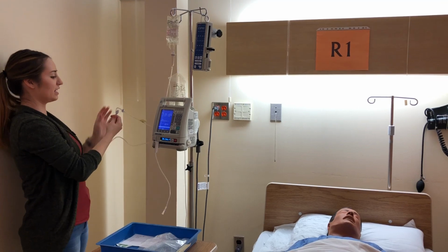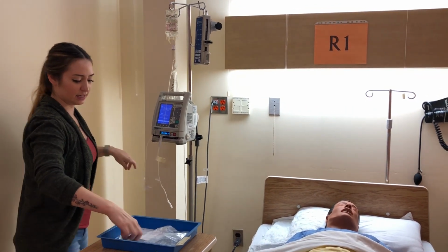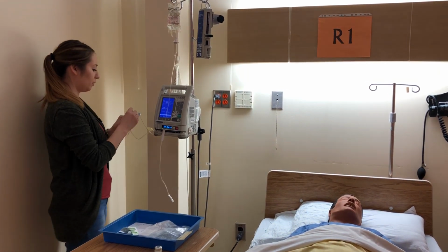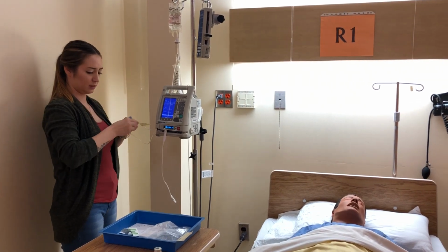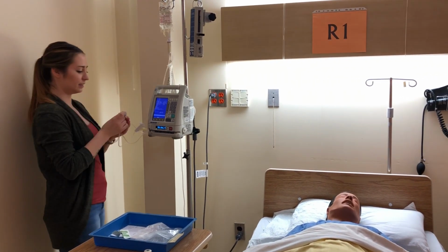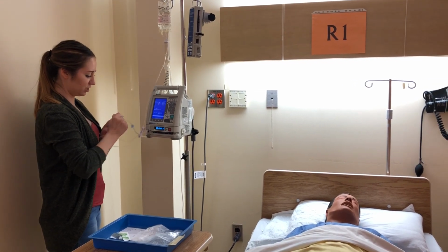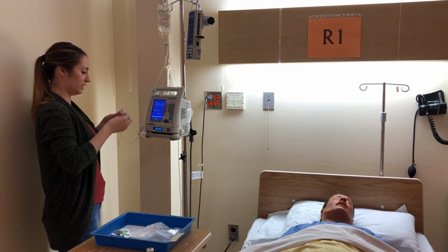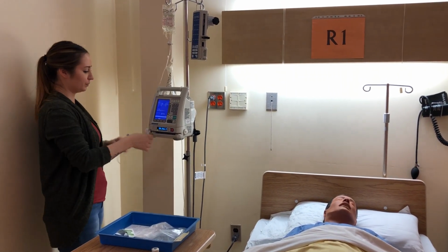I'm going to choose to attach it to the port above the Baxter pump so that the pump can regulate the medication. I'm going to swab the port for 30 seconds and let it dry for 15 seconds. I'm also going to check the compatibility. This drug is compatible with D5W, and because the doctor didn't order any D5W, we're just going to leave it. Then I will spike the bag and hang it, maintaining sterile technique, and attach my secondary line to the primary line because it's also the current IV.